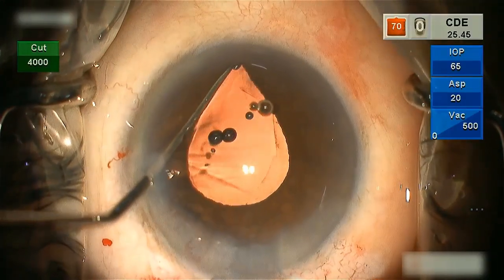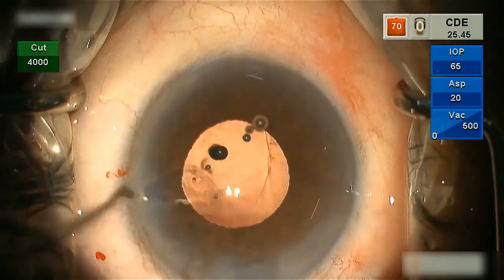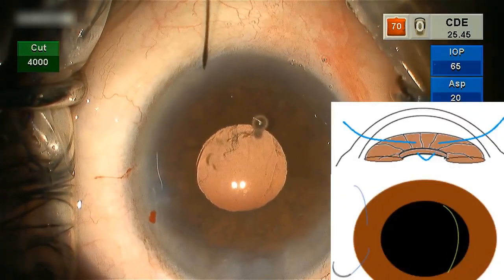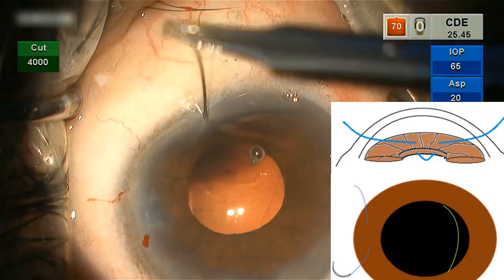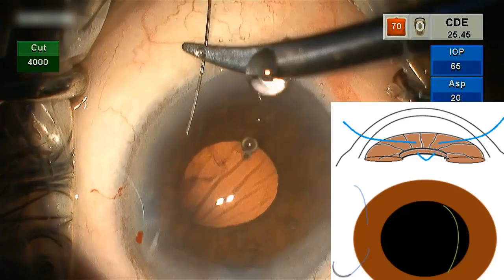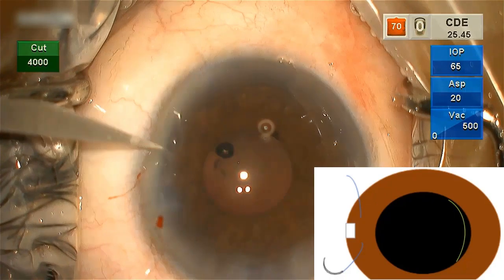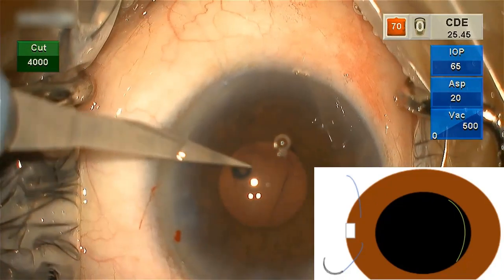Here we show you how to approach a case where only half bag support is present. A 10-0 prolene suture on a long curved needle is passed through the cornea, iris, and then externalized. The suture bites have to be placed in the mid-periphery of the iris. A paracentesis is made in between the two suture bites.